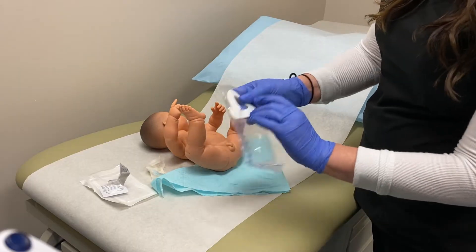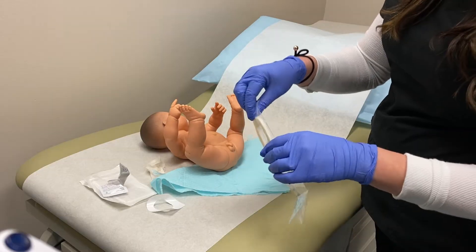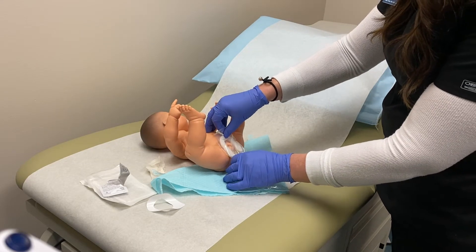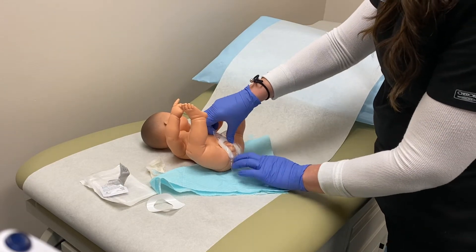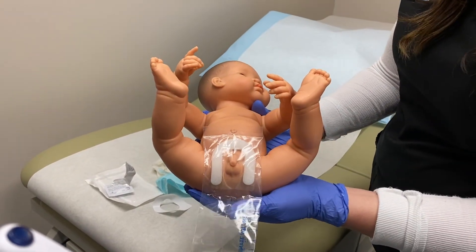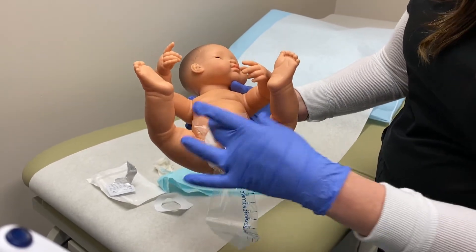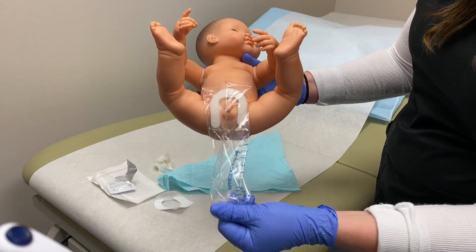So we have our bag, and the bag has a peel-and-stick on it. We are going to put this right over this little guy's bottom area. Let me lift him up so I can show you. You can see that the bag is covering his genitalia, which will allow him to urinate into the bag.